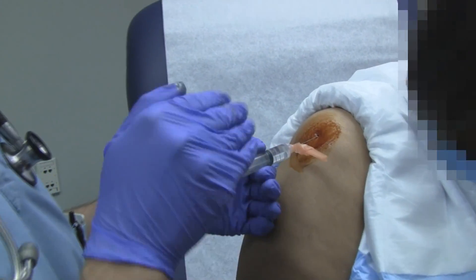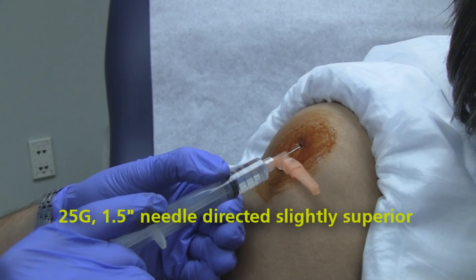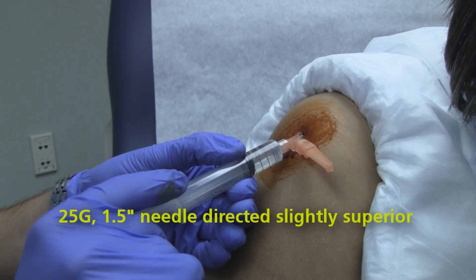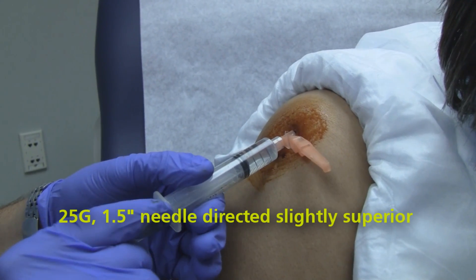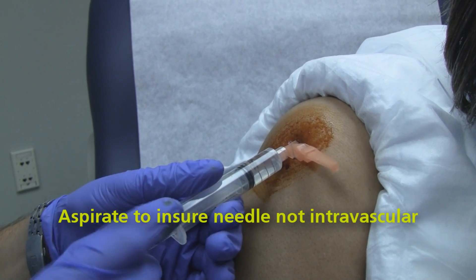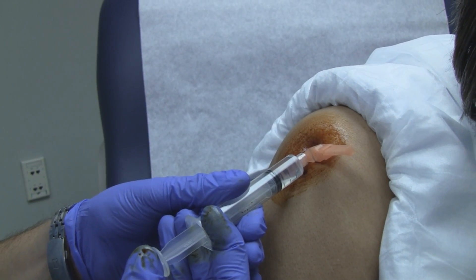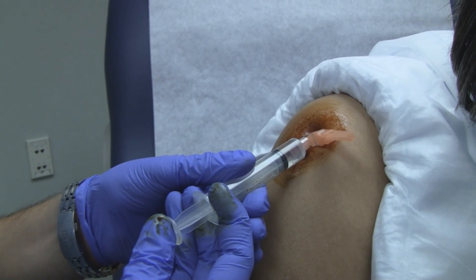You just go in and aim a little bit, trying to slide right under the AC and a little bit superior using a one and a half inch needle. So we're in. We'll aspirate back, make sure we're not in any kind of vessels, and we'll go ahead and inject. Now if you meet periosteum when you're doing this, you can pull back.